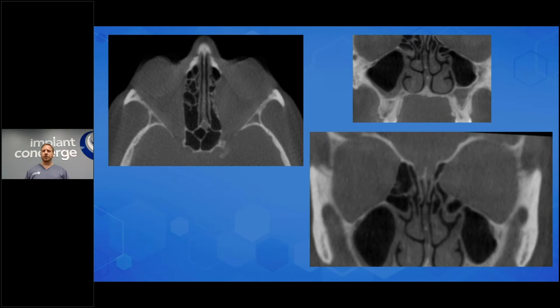But here, this is your lateral or medial rectus of the eye potentially having something associated with it. But as you can tell, it's round. There's no interruption of that cortical outline. But the really interesting part is, why is the left maxillary sinus also extremely small?